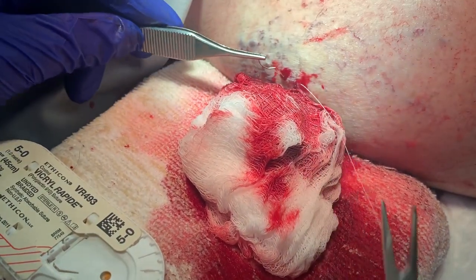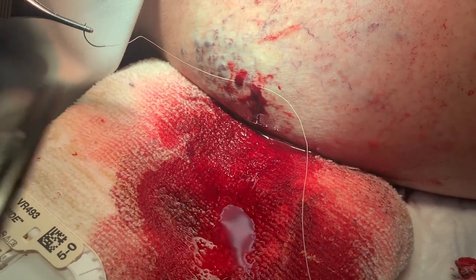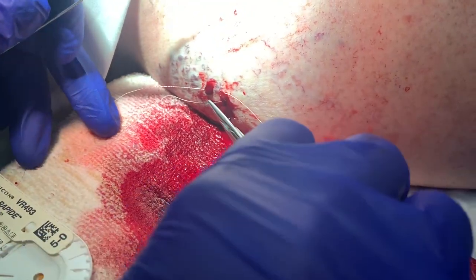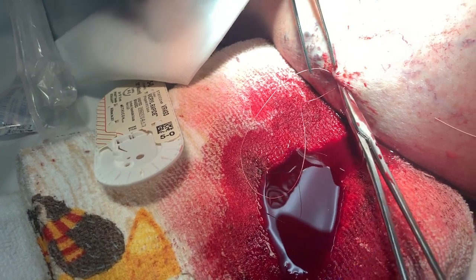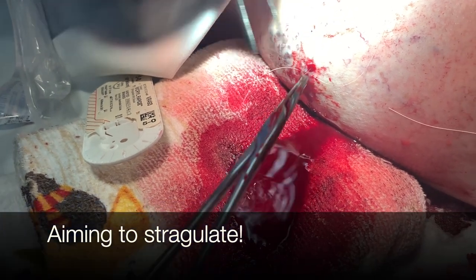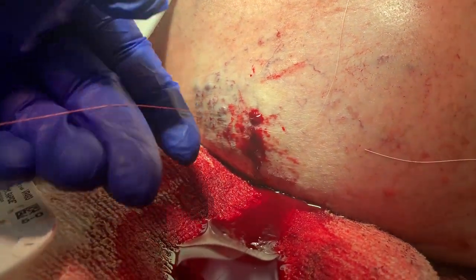I just don't want it to get on your phone. I think it does — it's not a big deal. So we've already got a little bit of stopping here. I'm just going to go around, back up. I'm going to try and strangle this guy so he stops bleeding. There we go — you've already got immediate stasis.